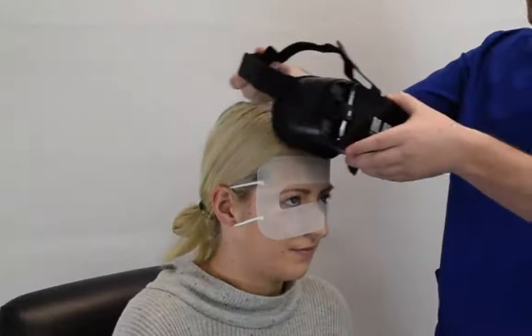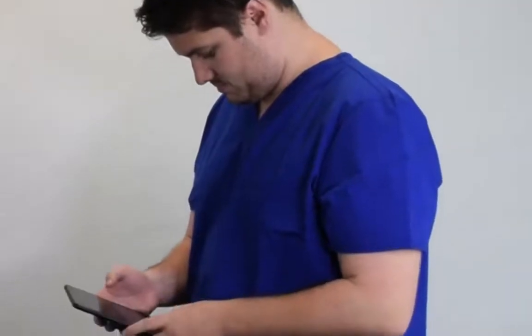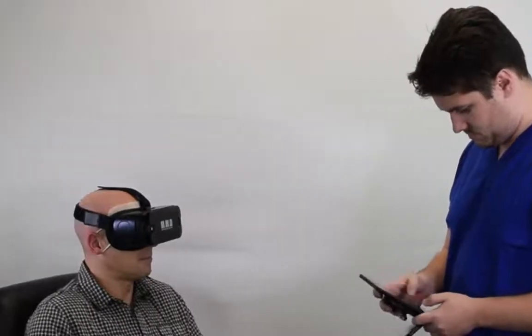Once you have a patient set up in a comfortable position with the VF2000 secured in place using the straps on the device, you can choose the test or screening you wish to run from the menu on your tablet. Tests are run conveniently from anywhere in the area using your tablet.